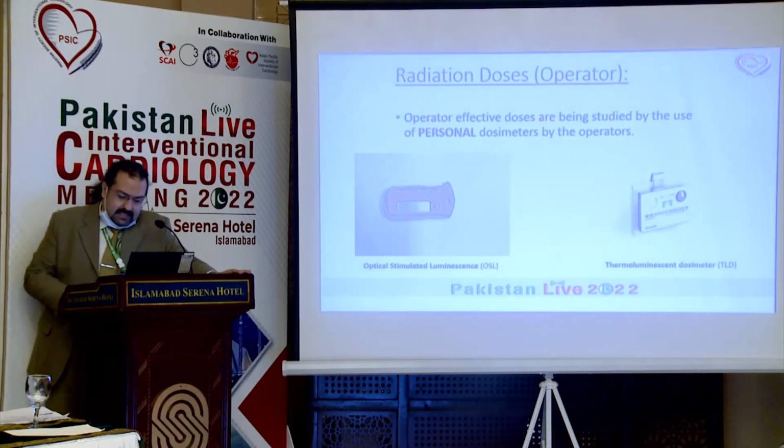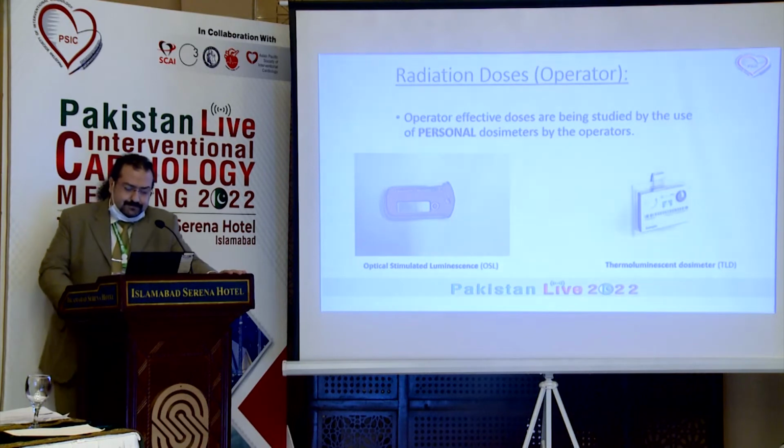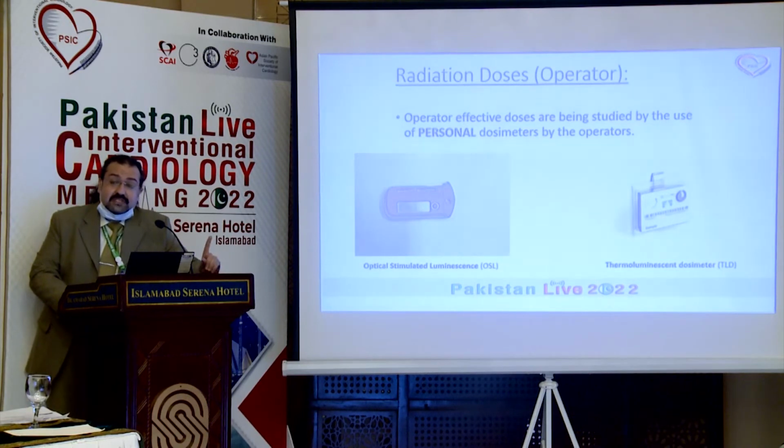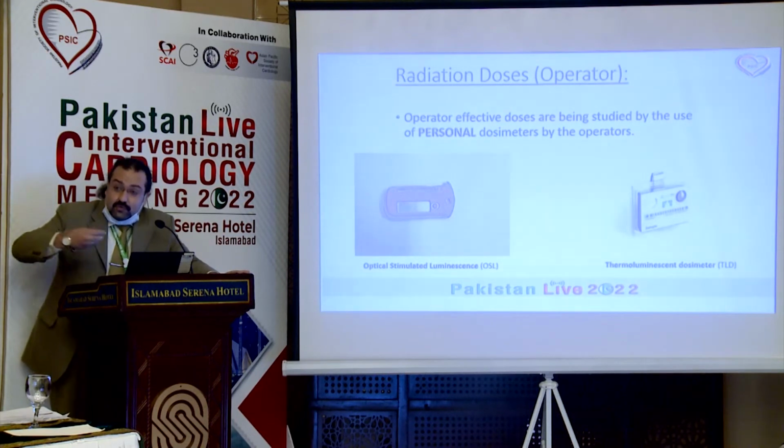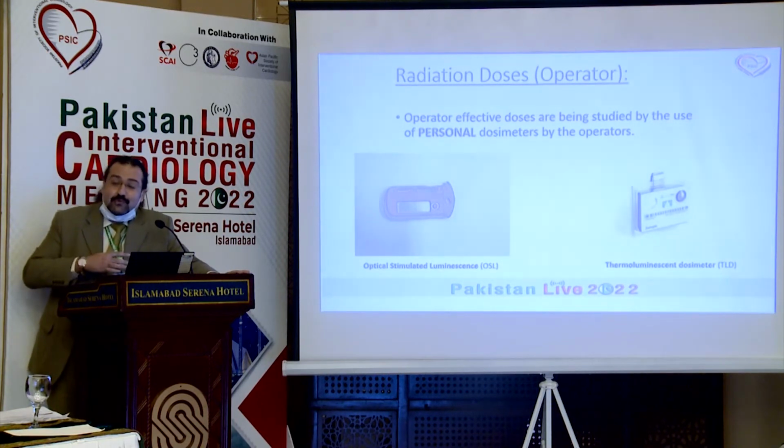One type is optically stimulated luminescence, which we call OSL, and the other one is the TLD. And OSL, I think, is more common here in Pakistan. Everyone is supposed to have his own personal one. You cannot use your friend's or your colleague's. You cannot give yours to someone else. It has to be only for you, and it has to be worn all the time for accurate measurement.